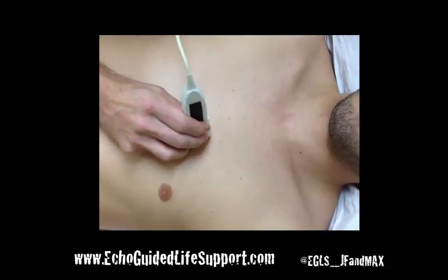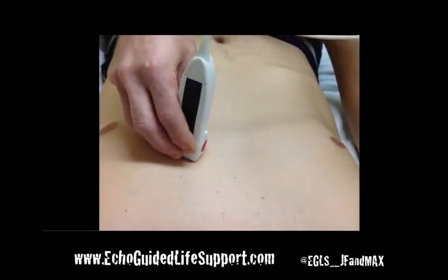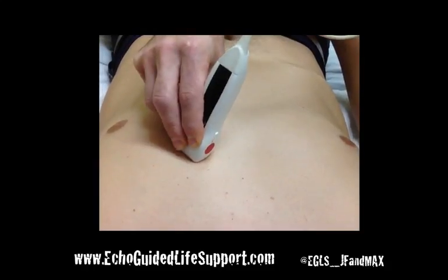And once we get something that looks like a parasternal long axis view, we'll then optimize the view by doing rotations to put the probe in line with the long axis of the heart. Then, by tilting laterally, we'll find the plane of cut that goes through the middle of the left ventricular cavity.